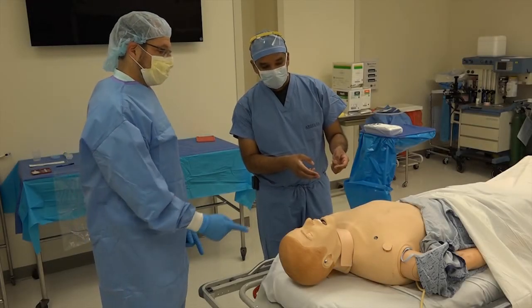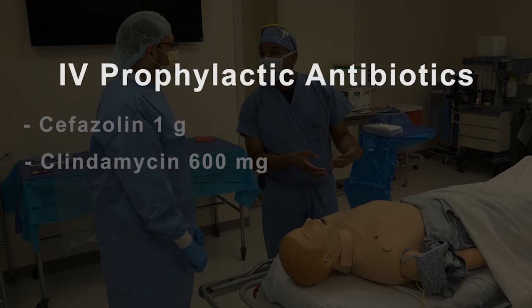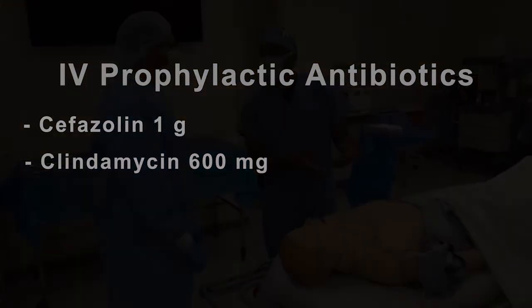Prior to initializing the procedure, make sure you have reviewed the indications and contraindications for a tube thoracostomy. Also, ensure that you have selected the correct side. Begin by administering prophylactic antibiotics. Cefazolin 1 gram intravenously or clindamycin 600 mg intravenously for penicillin-allergic patients is appropriate.